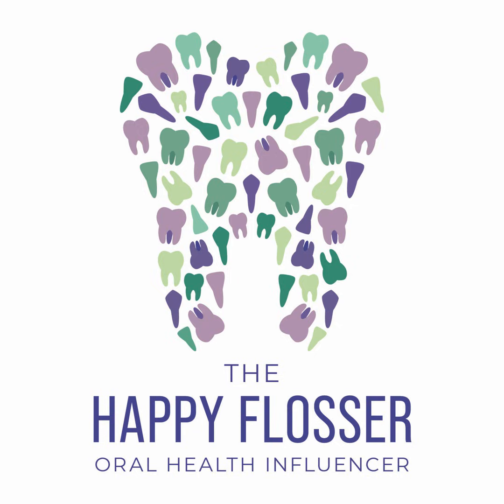And then the other piece is that if the roots of the teeth are shorter and the crown to root ratio is abnormal, where there's not enough bone supporting the root of that tooth, the susceptibility of that tooth being lost due to periodontal disease goes way up. So that's a significant finding for you to note when you are doing your radiographic interpretation.